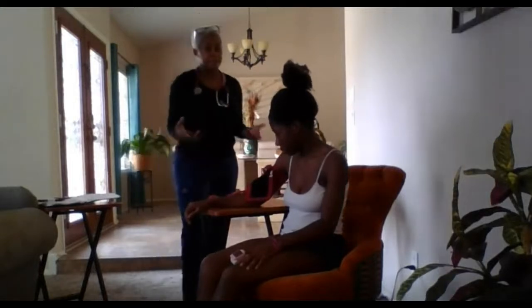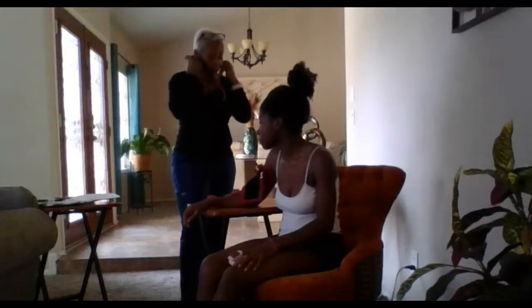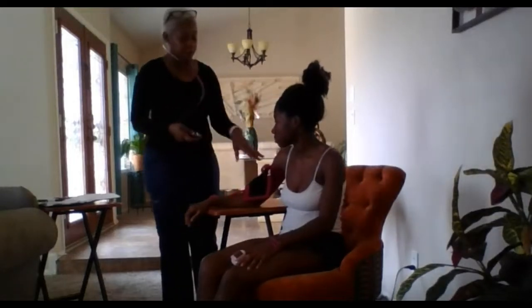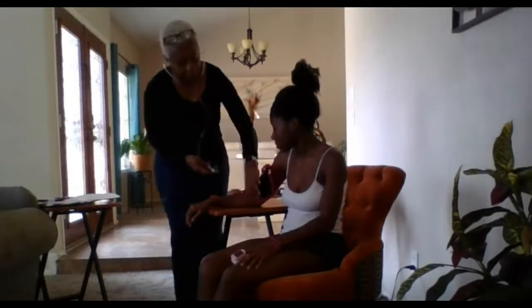And I'm going to wait 30 seconds. And then after 30 seconds, I will listen for her blood pressure. And that means, because I stopped hearing her radial pulse at 100, I'm going to pump it up to 130.